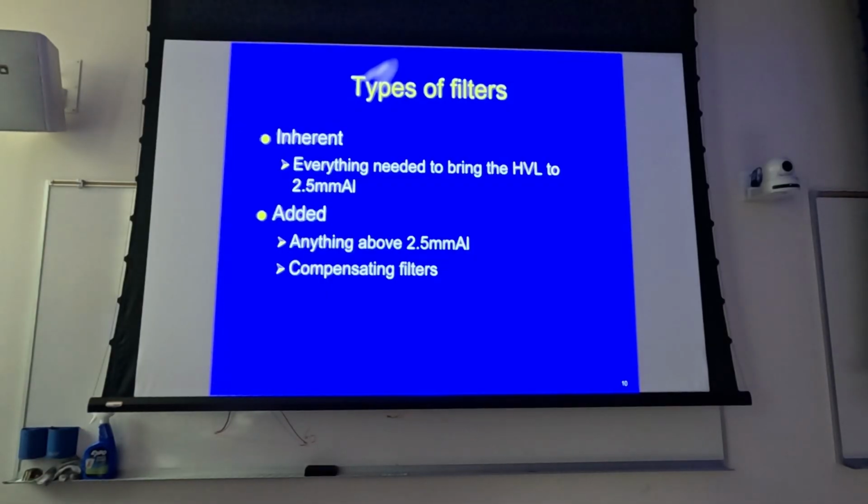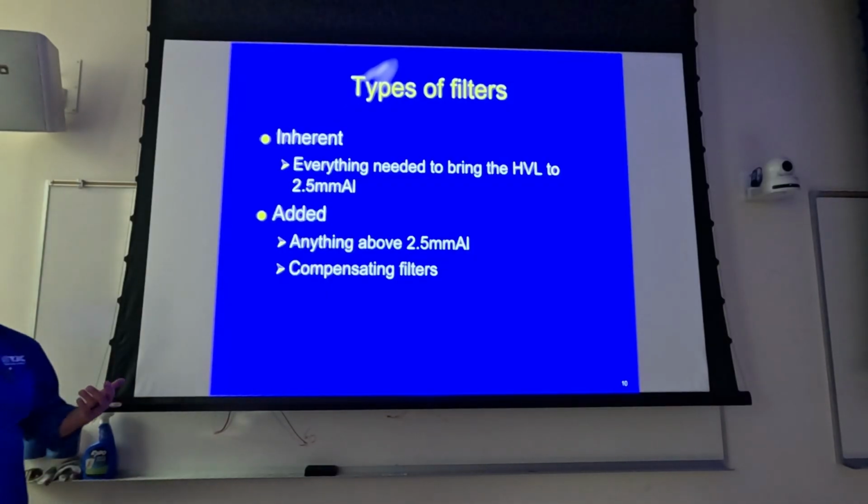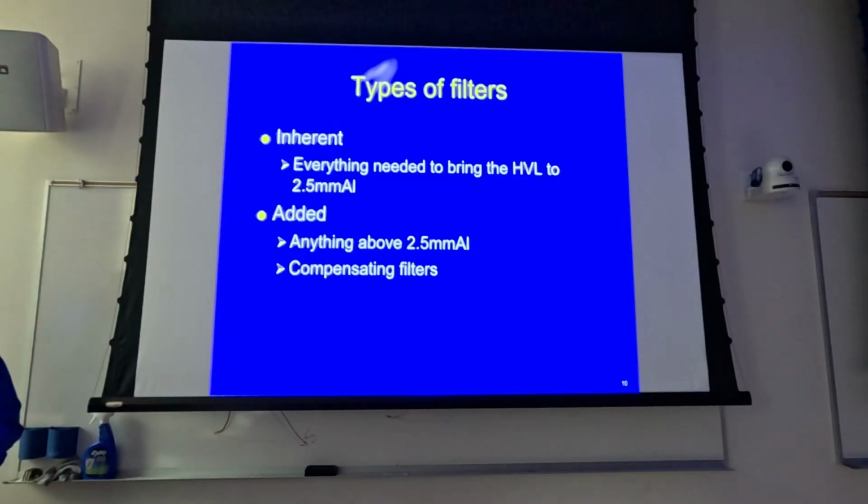I'll use an example of a foot. Back when we were using screens and films, you had to shoot the foot for where the patient's pain was. If they ordered foot and the patient maybe dropped something heavy on the distal portion of the metatarsals, then you would select a totally different technique than if it was closer to the ankle.